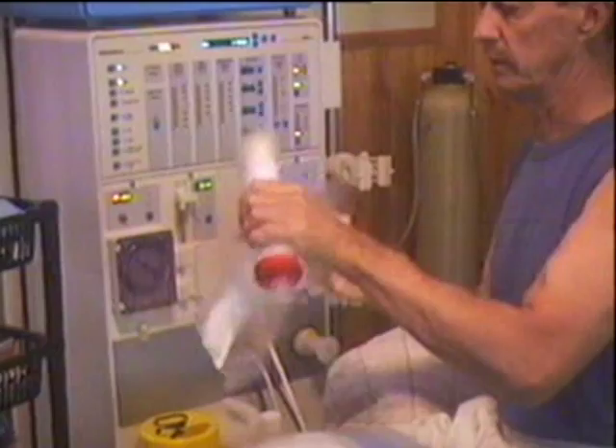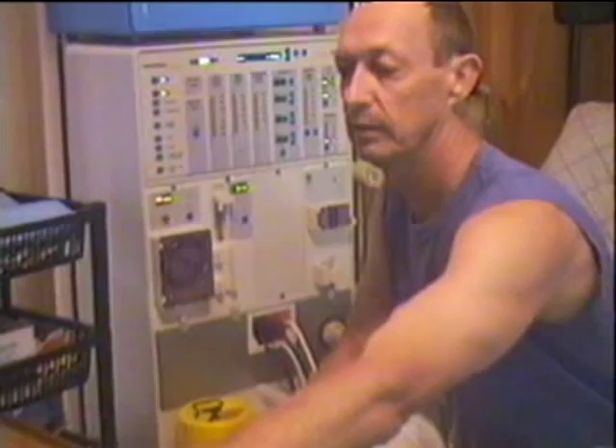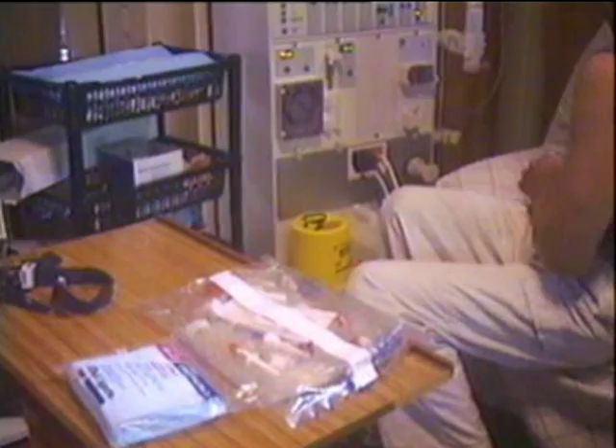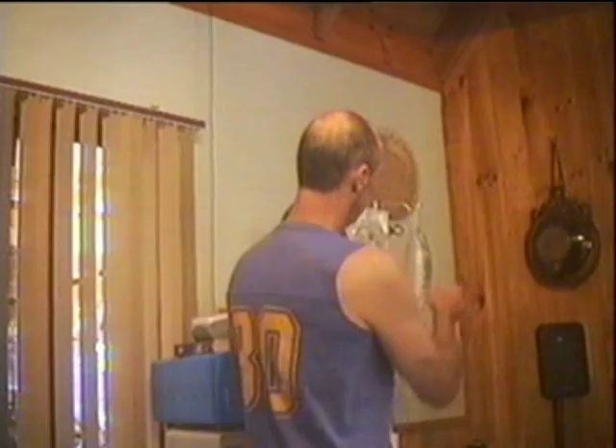Firstly, we'll start with the kidney — kidney in there. And these are the tubes for the machine. Two bags of saline, which hang up on the hook. Everything is sealed. I've washed my hands nice and clean before starting all this process so you don't contaminate anything.